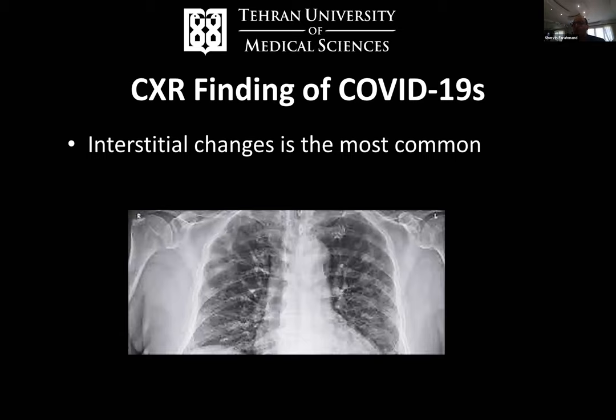One of the most common findings is interstitial changes, as you see in the figure. This finding is not specific for COVID, and any kind of interstitial pneumonia with viral or bacterial origin can mimic this presentation. It is not specific for COVID.